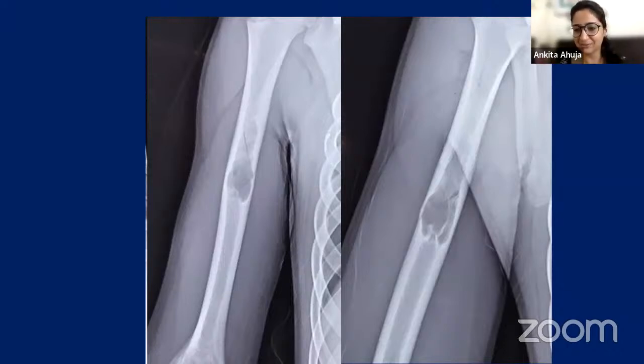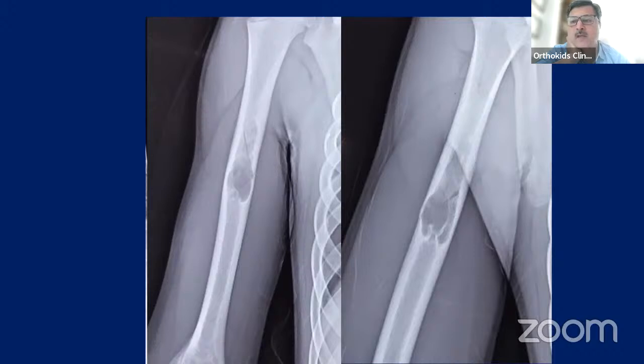Yeah, so I agree with whatever Ankur sir mentioned. Just that because of this atypical location, diaphyseal in pediatrics, usually not many lesions are there. So I would also keep a differential of EG over here. I would think of eosinophilic granuloma also significantly because of the endosteal scalloping, the way the appearance is.